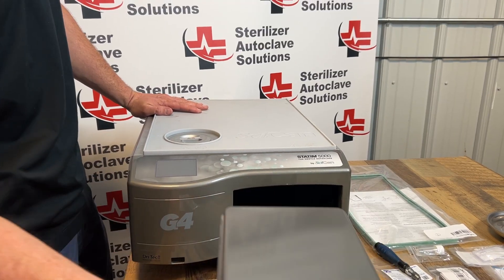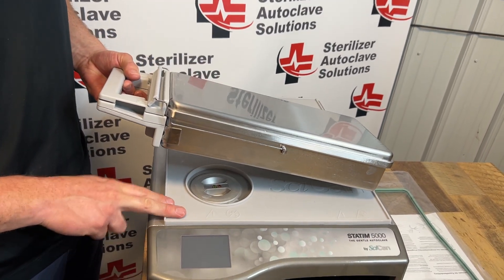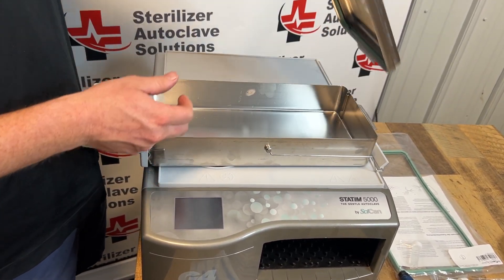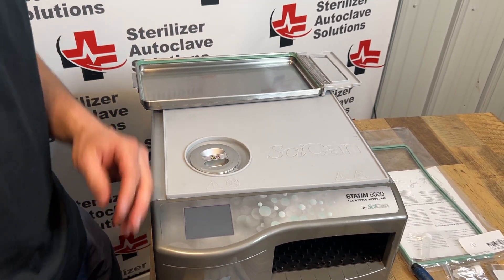We're going to remove this cassette. I am placing it on top of the unit; however, I have a STATMAT so I'm not going to scratch the paint. I'm going to separate the top from the bottom, setting the bottom off to the side.